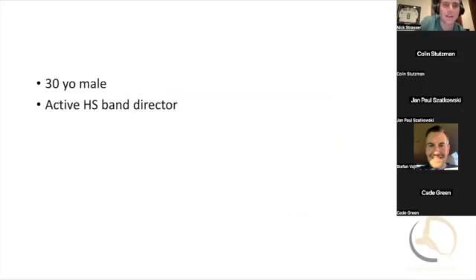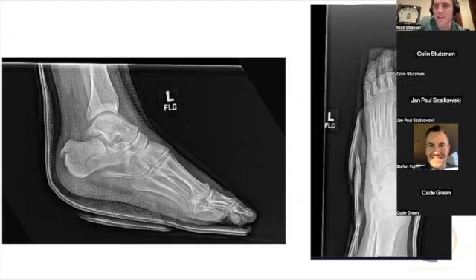This is a 30-year-old male, active high school band director, who jumped off some bleachers and has this injury. I don't have an axial view, but not a ton of deformity on the axial view. Here are his AP and lateral views.